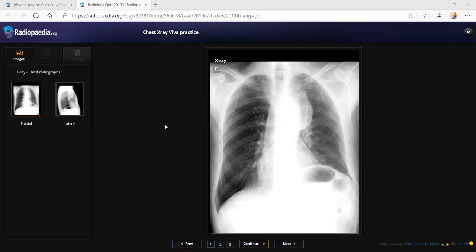I'm provided with the frontal and lateral chest radiograph of a skeletally mature adult patient. I can see a radiopacity which is present in the upper left paramediastinal region adjacent to the descending aorta, along with the raised left hemidiaphragm. The surrounding lungs show some fibrotic changes. The background skeleton appears to be grossly unremarkable. There is some subtle pleural thickening I can see on the left lateral aspect.